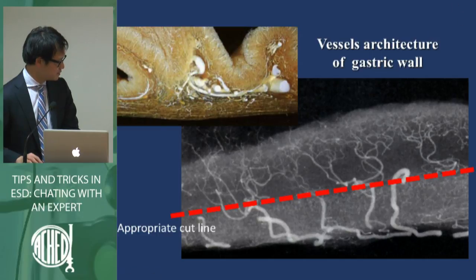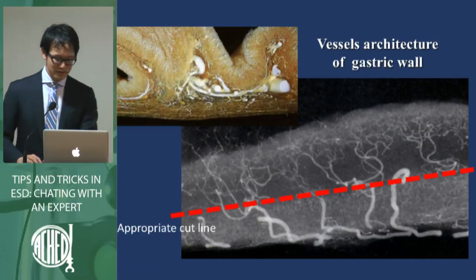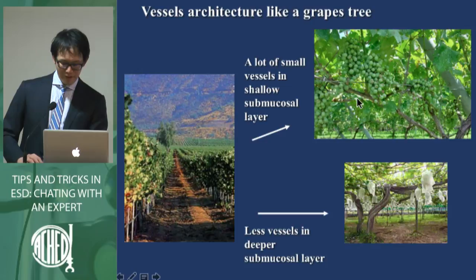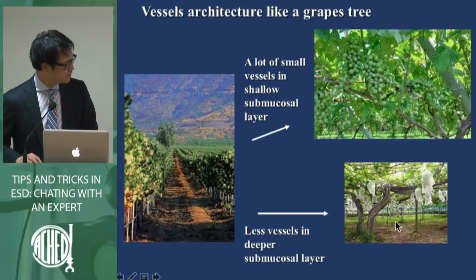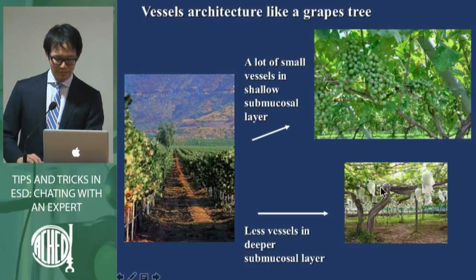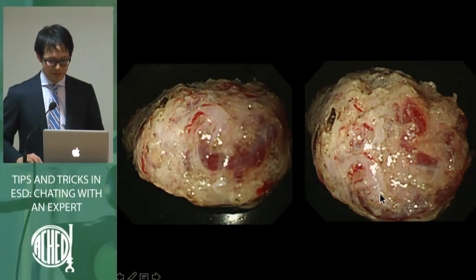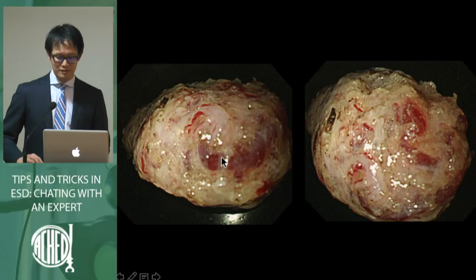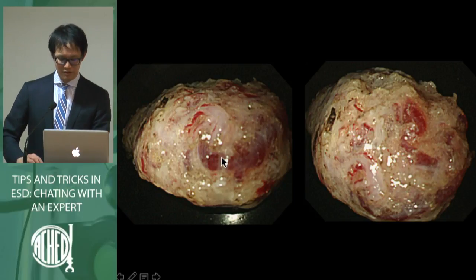In ESD it's important to use appropriate cut lines. The vessel architecture is like grape trees. If you go into the submucosal layer, there are fewer vessels than just below the mucosal layer. You can see the vessels are removed with the tumor. This is appropriate, you can see the vessels. So this is the appropriate cut line for resection.